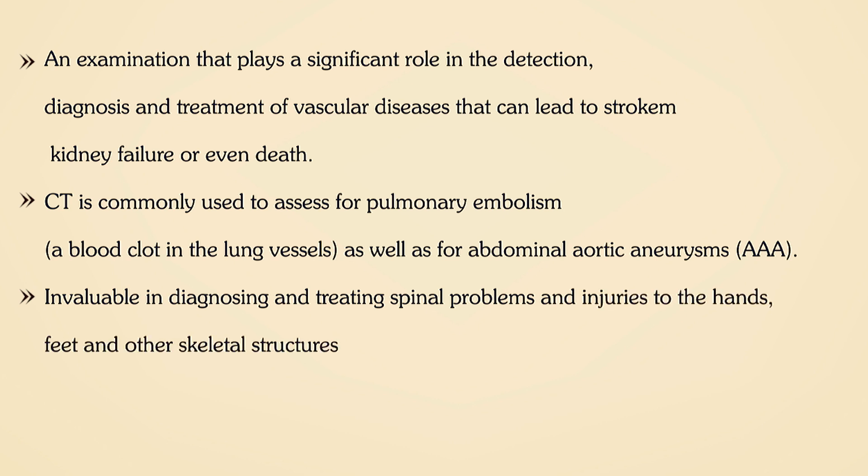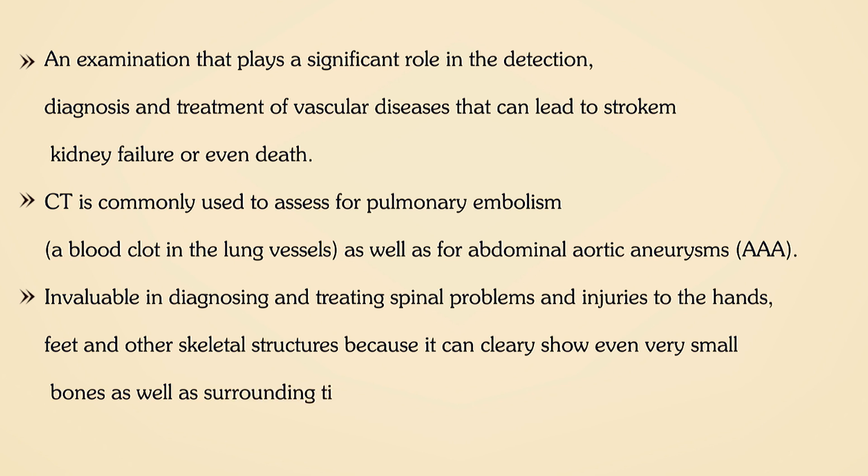Invaluable in diagnosing and treating spinal problems and injuries to the hands, feet and other skeleton structures, because it can clearly show even very small bones as well as surrounding tissues such as muscle and blood vessels.